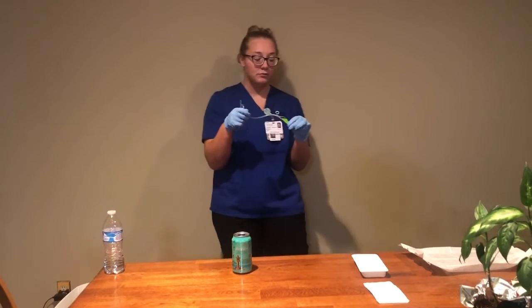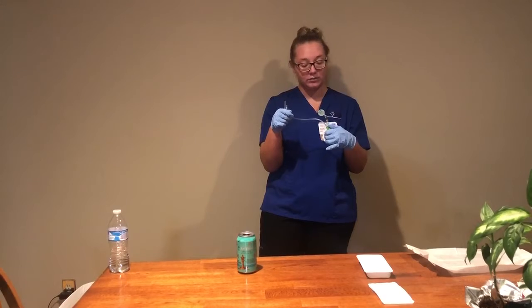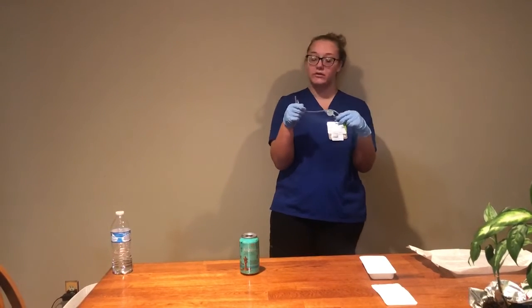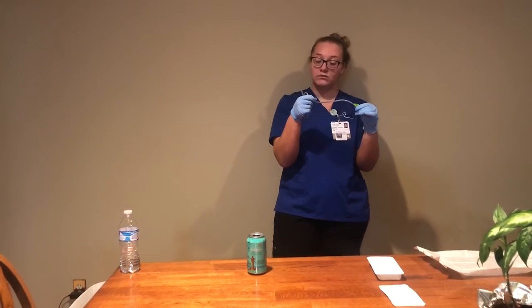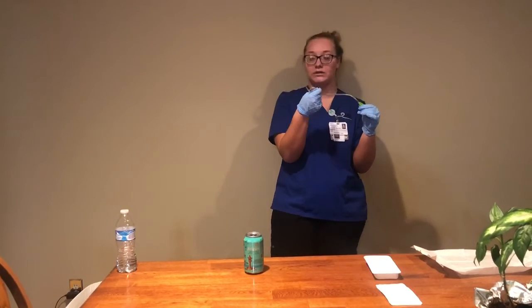So then after that, I'm going to check to see if it's suctioning right. So I would put my thumb over the port to make sure it's suctioning right. So now that this hand is clean and this hand is still sterile, I would re-moisten this if needed, and it's still pretty moistened, so I'm not going to.